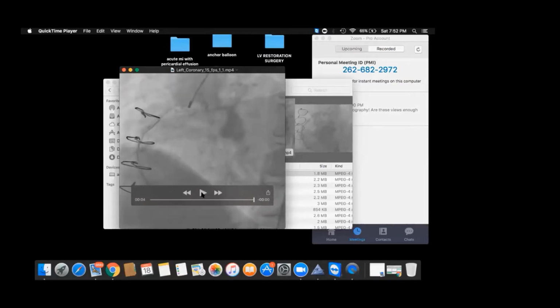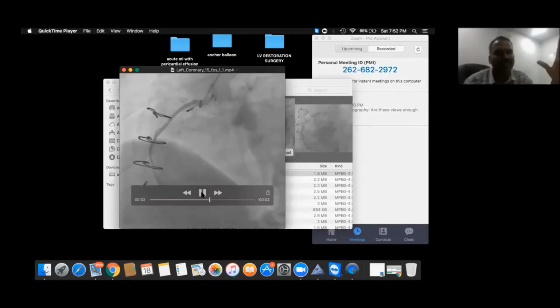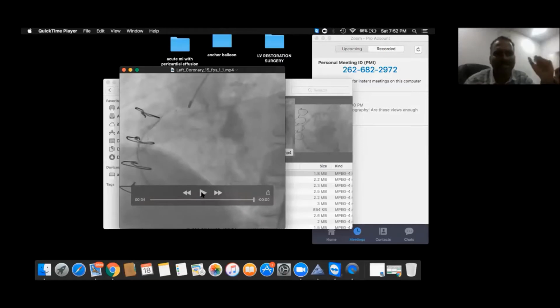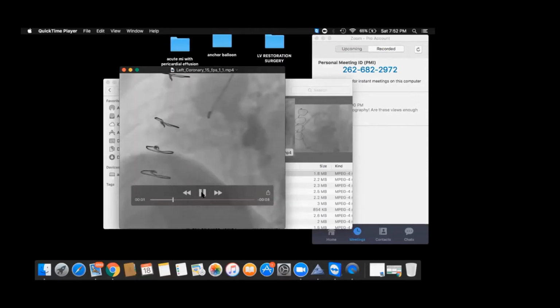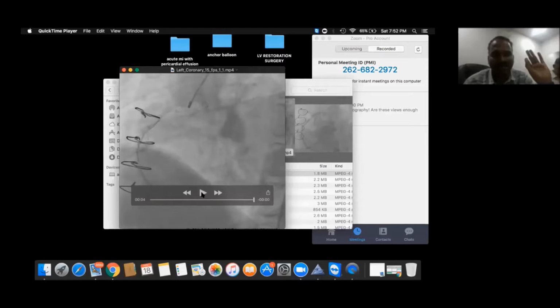It is not covering. No. I mean, basically it is very difficult to tell in this view. But by and large, for me, it is appearing that it is covering. Okay. Are you able to see any lesion there? Not really. There is a good reflex also. So there is no lesion at all, right? It appears the stent is covering the lesion.